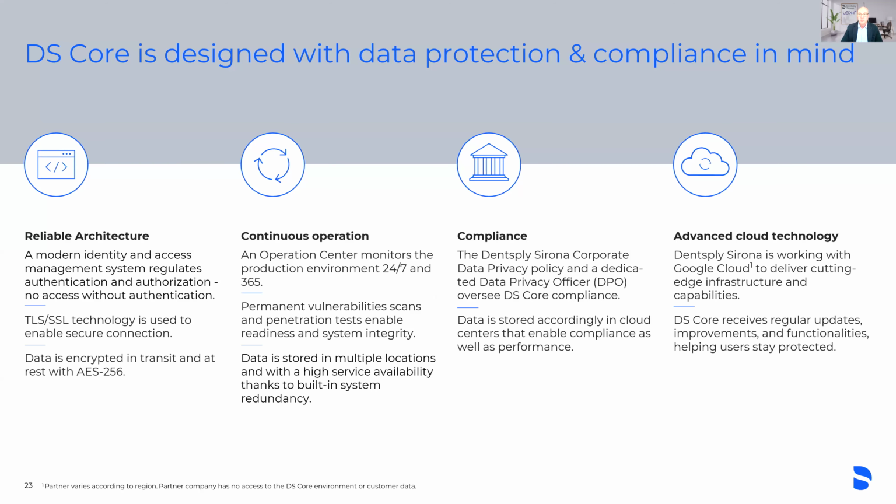So you no longer have to worry, is your data safe or your patient's data safe? DS Core is 100% HIPAA compliant, and all the communication that happens through DS Core is 100% HIPAA compliant. So very important for both the lab and the clinician and the patient.